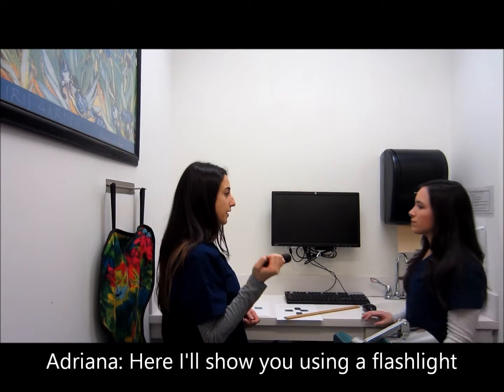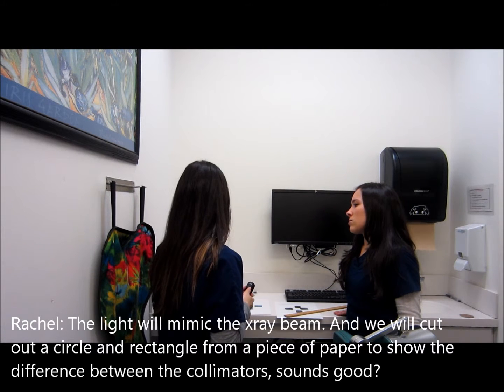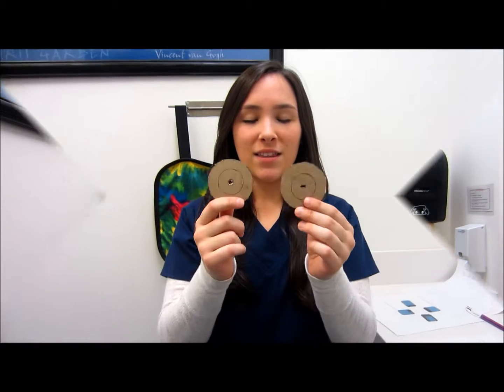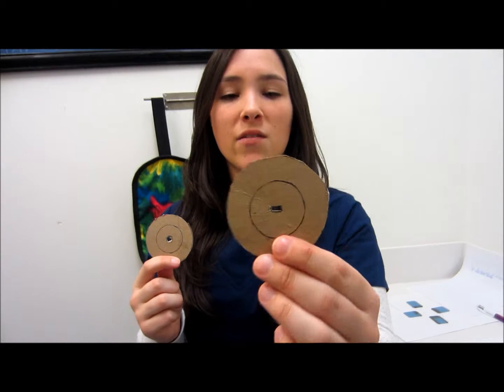Here, I'll show you using a flashlight. Okay, the light will mimic the X-ray beam, and we'll cut out circles and a rectangle from a piece of paper to show the different kinds of collimators. That sounds good? Yep. Alright, these are going to act as the collimators. This is a round one and a rectangular one.